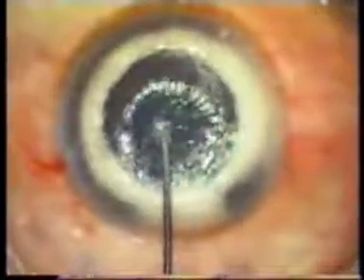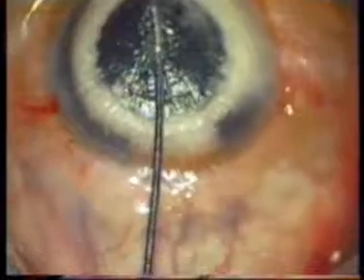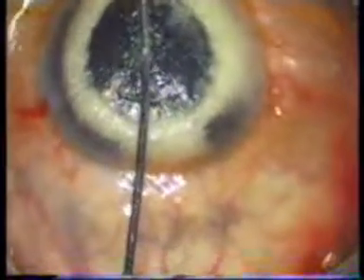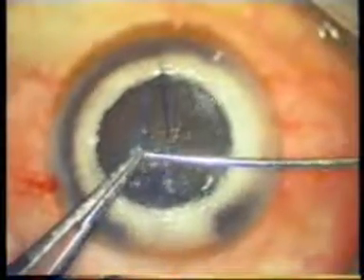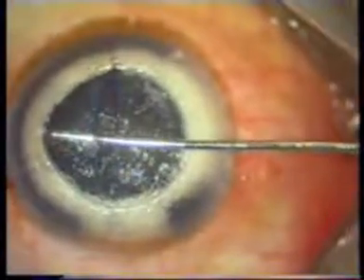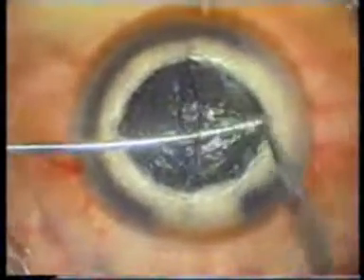An iris spatula is inserted through the tiny opening made by the sharp-tipped knife. The spatula is carefully advanced in the cleavage plane created by air until its tip approaches the trefination groove. Although the spatula is in direct contact with the Descemet's membrane, the risk of perforation is minimal as it is blunt and passes easily in the potential space enlarged by the bubble. The spatula is held steadily and firmly while it is gently lifted anteriorly, slightly tenting the residual stromal layers.